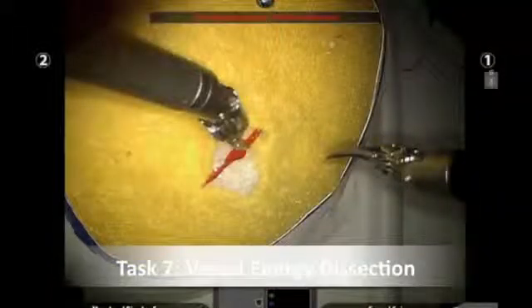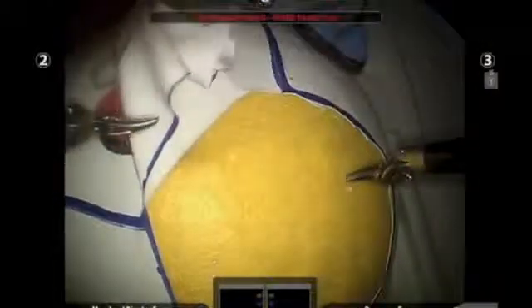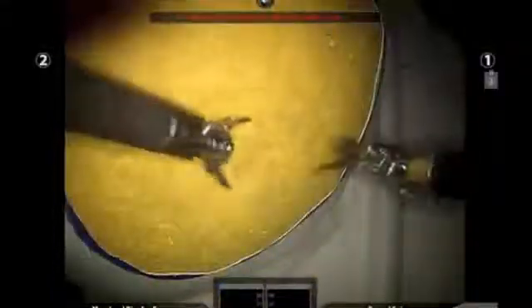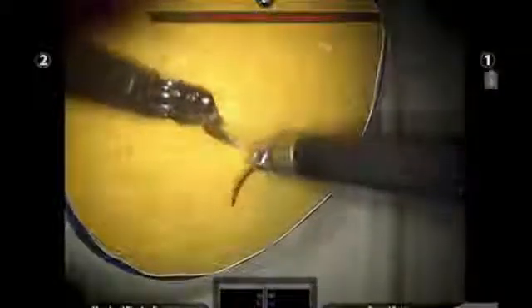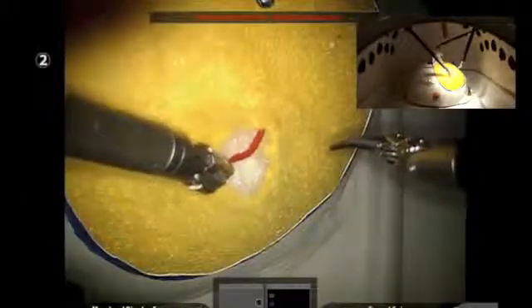The last task, task number 7, is vessel energy dissection. Here, the learner retracts the cutout flap with the fourth arm, dissects through the underlying tissue to expose the vessel, and uses the bipolar instrument to cauterize and finally cut with the monopolar scissors. This exercise utilizes 2 sources of energy and evaluates dissection, cutting, and use of multiple arms.